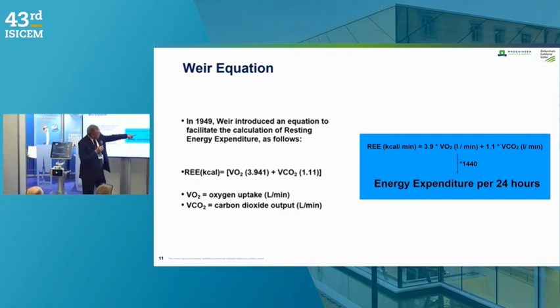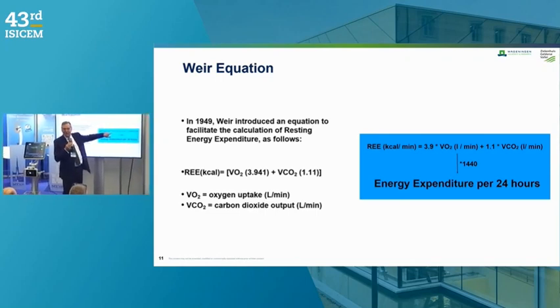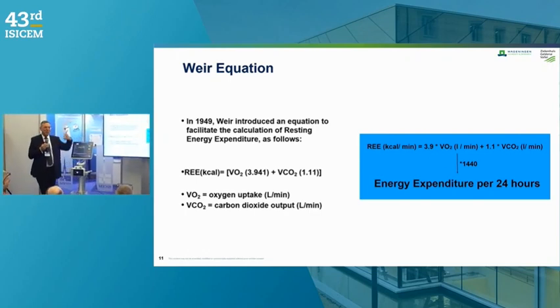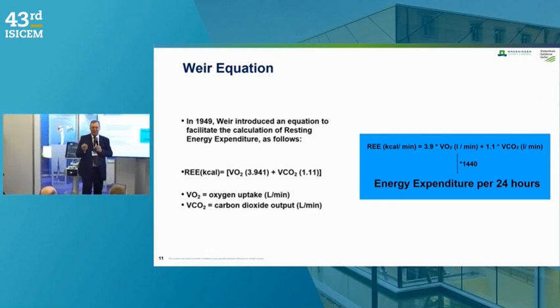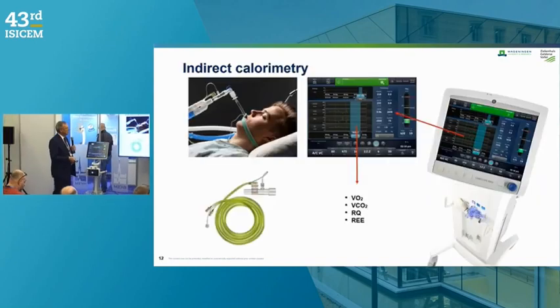And you can see here the error must be large because this is times 4. So you only know this one. And that's probably why indirect calorimetry is much better, because then you have both. And that's essential. So the VCO2 is maybe better than equations, but it's not the whole story. It's better to have full indirect calorimetry.